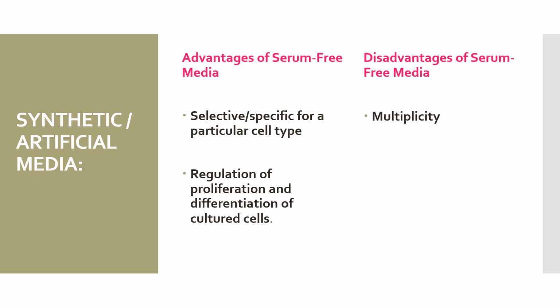So while the specificity of a serum-free media may be advantageous for isolating specific cell types, it is a problem for culturing several cell lines of different origins. Selectivity. Cells at different stages of development may require different media formulations, especially in the growth factor and cytokine composition.